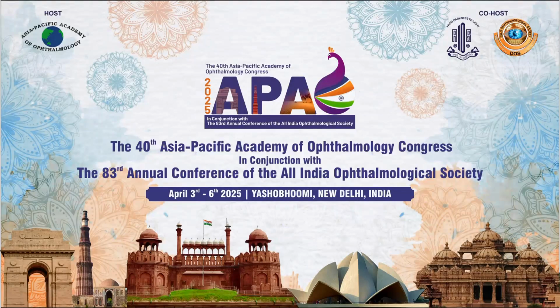Dr. Uma, wonderful. And it's a very important take-home message that once we are detecting a case of cataract and the pupils are dilated, the biometry should be done when the pupils are undilated to get the most accurate readings.